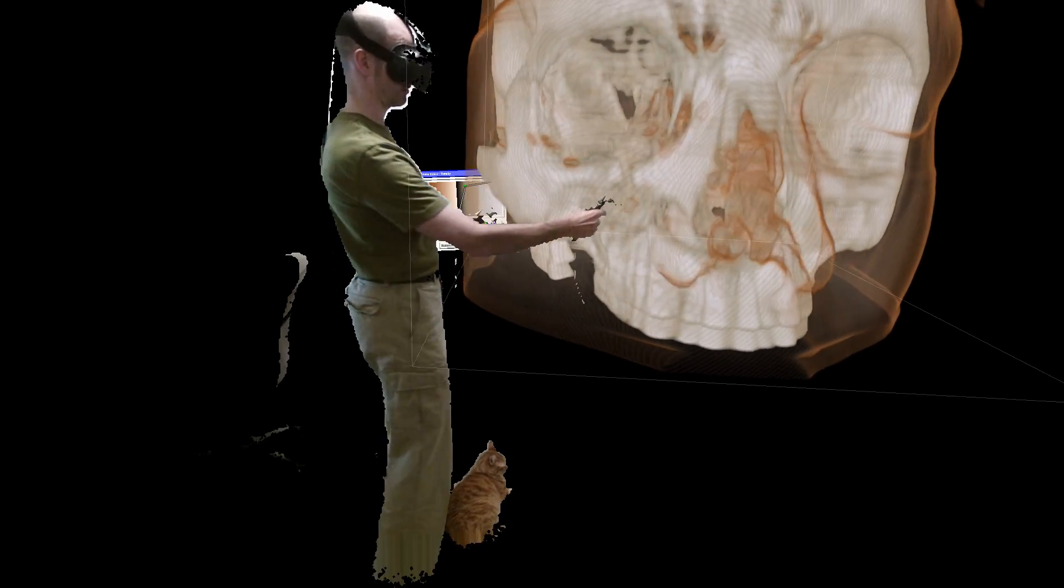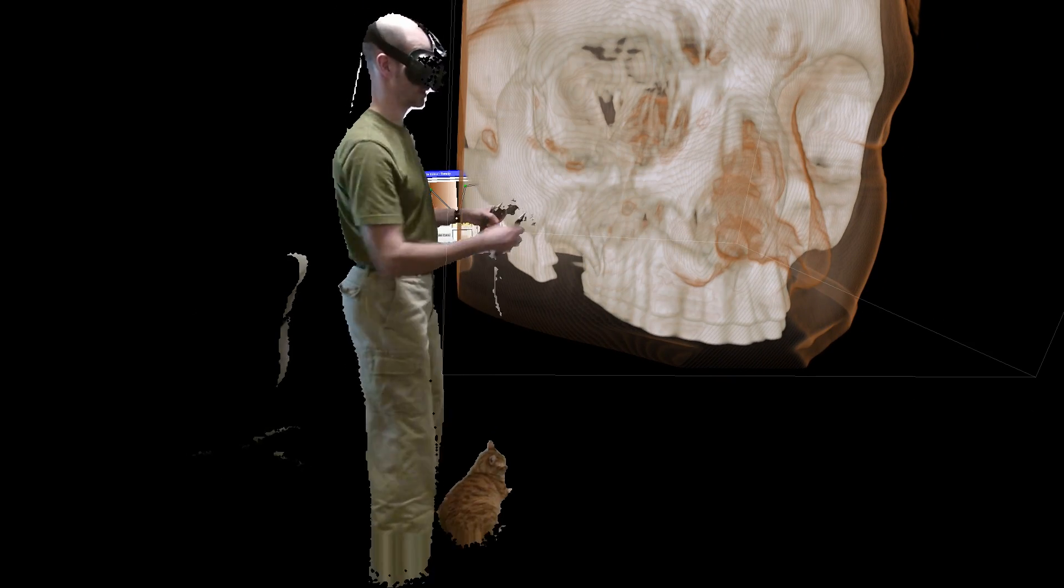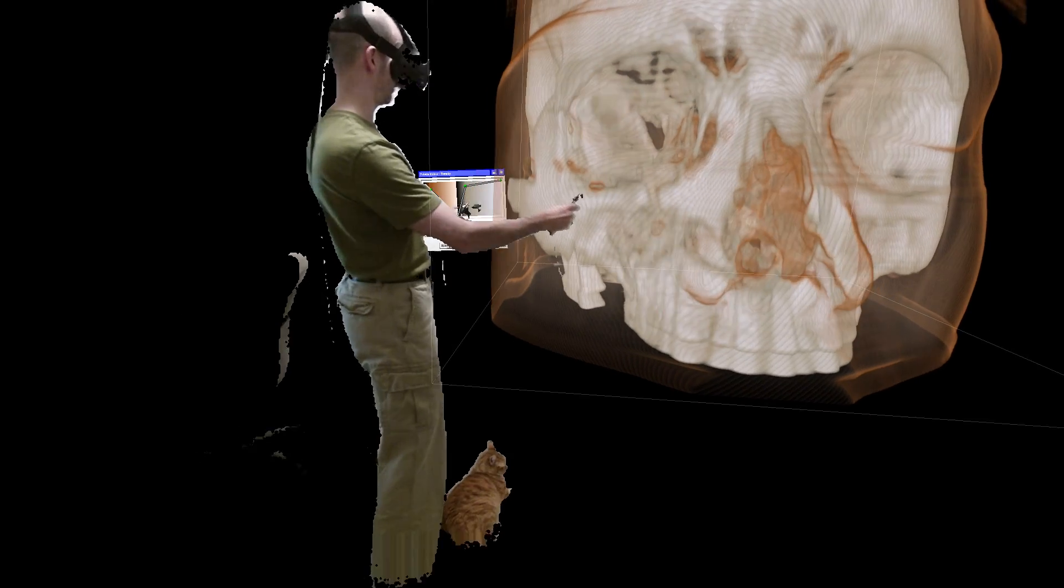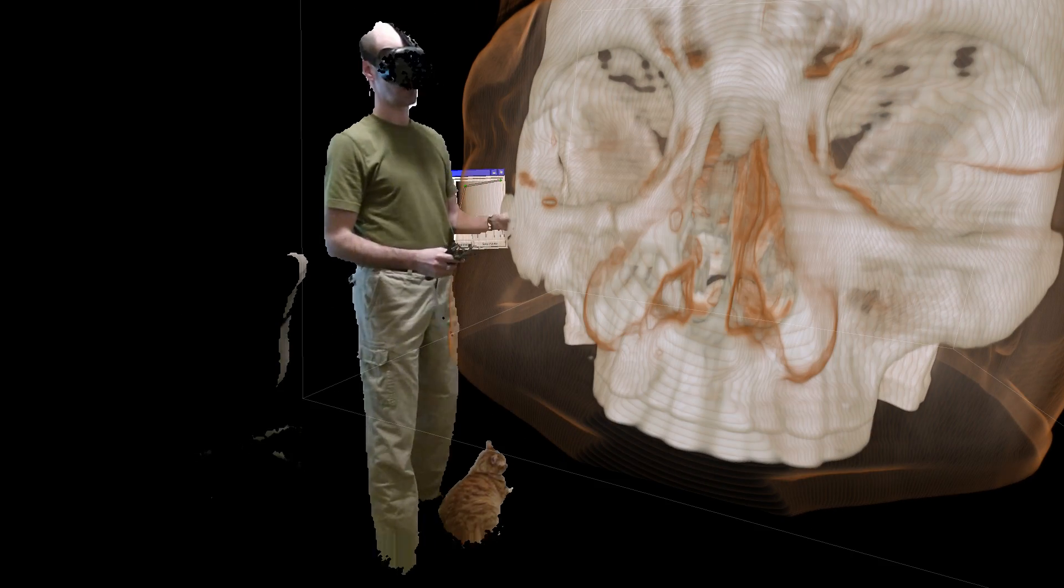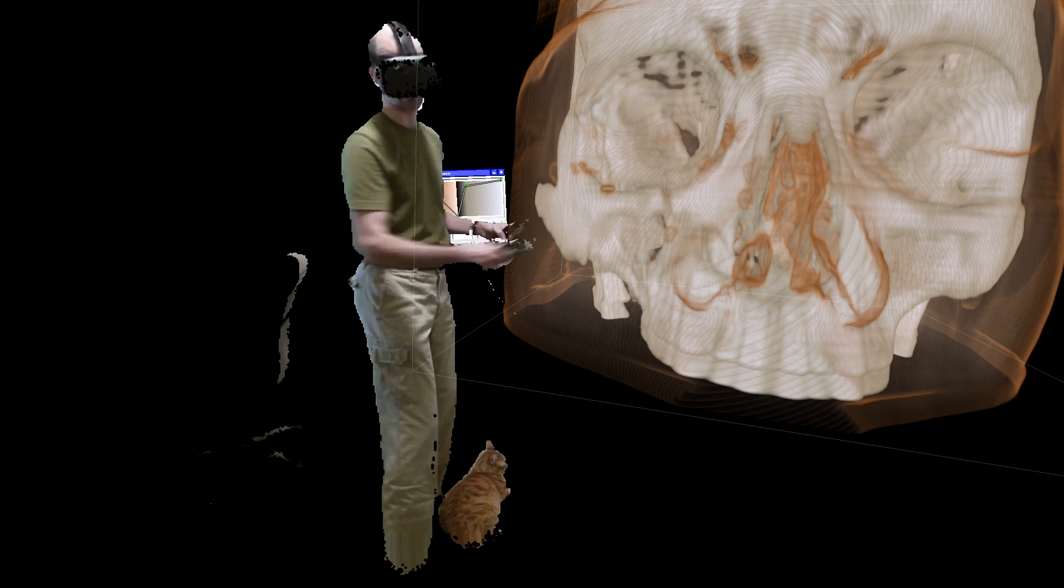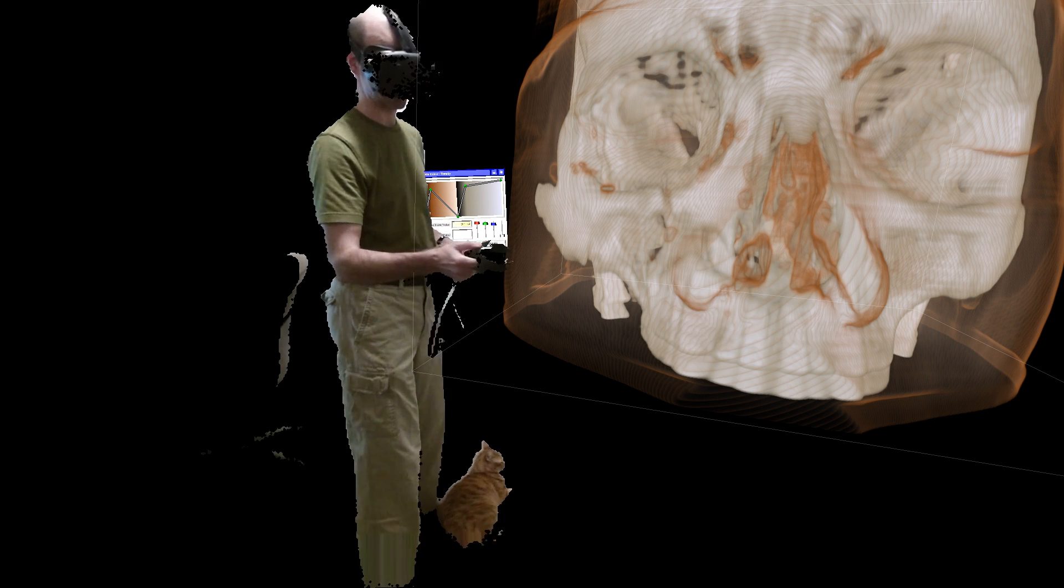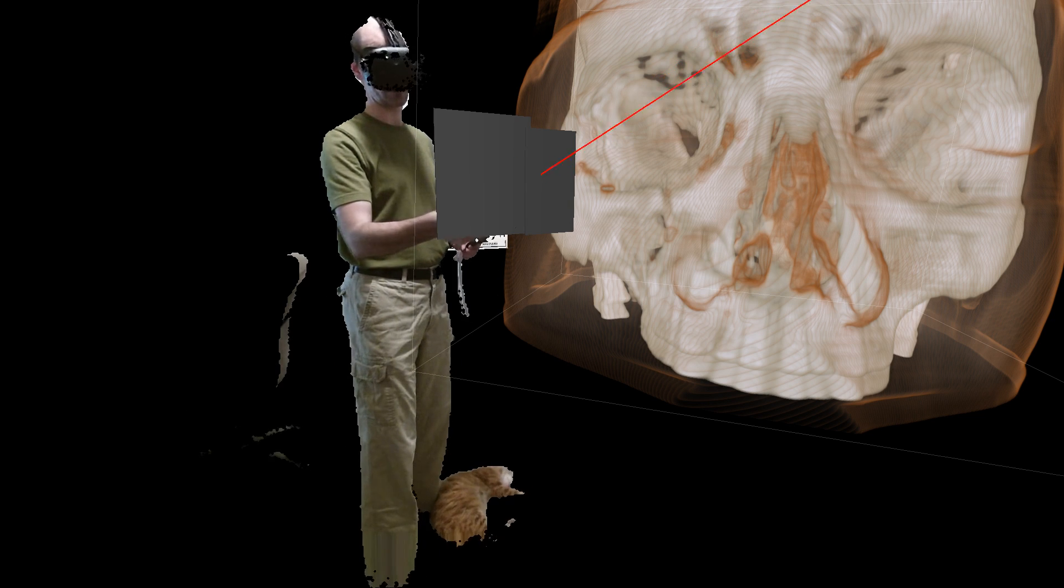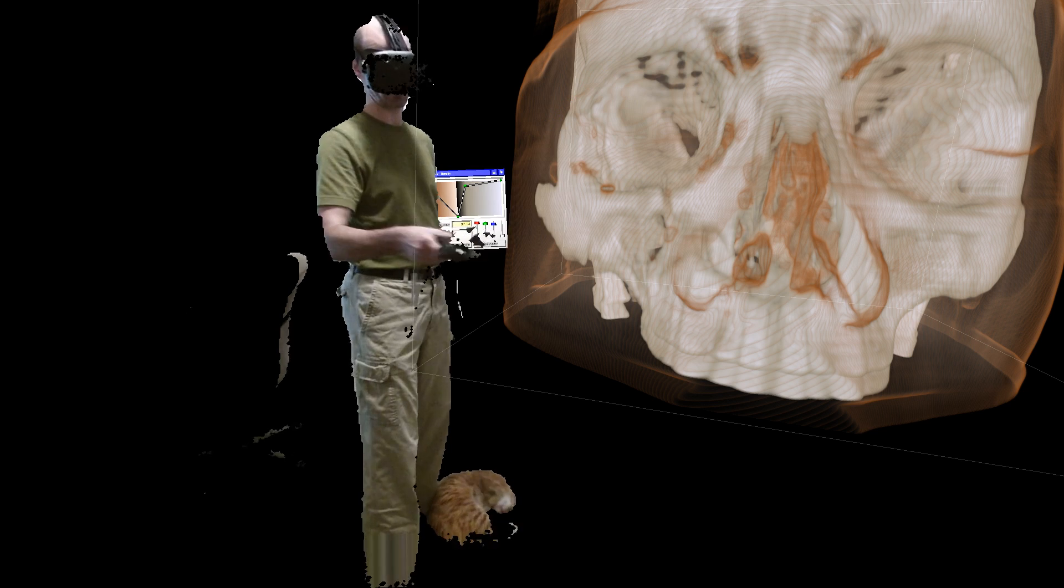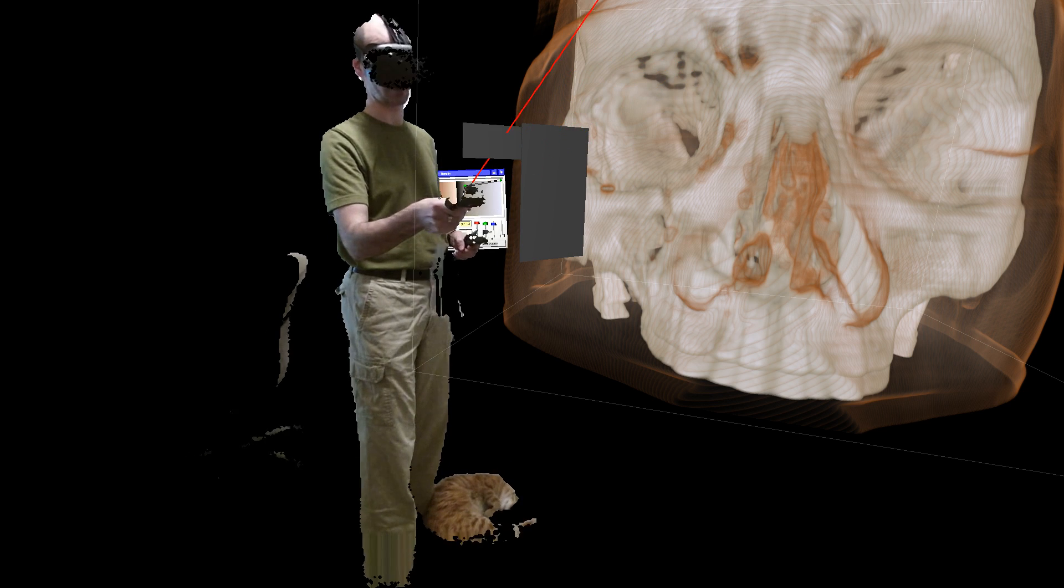And so now we can see what is really going on here. Now this technique is called volume rendering. It is good at getting a complete overview over the data, but it is sometimes a bit too fuzzy to see what's going on in detail. I'm going to combine this with a different visualization method.